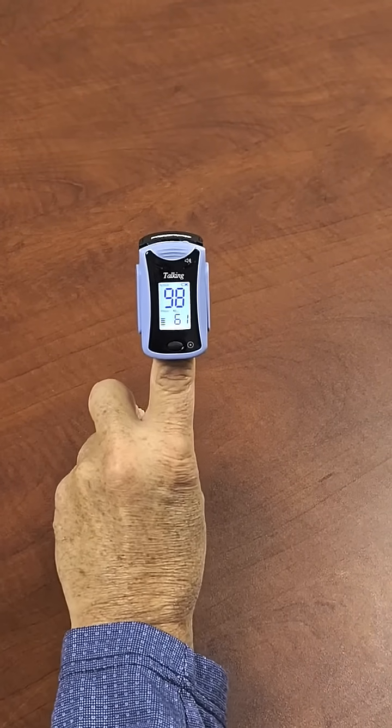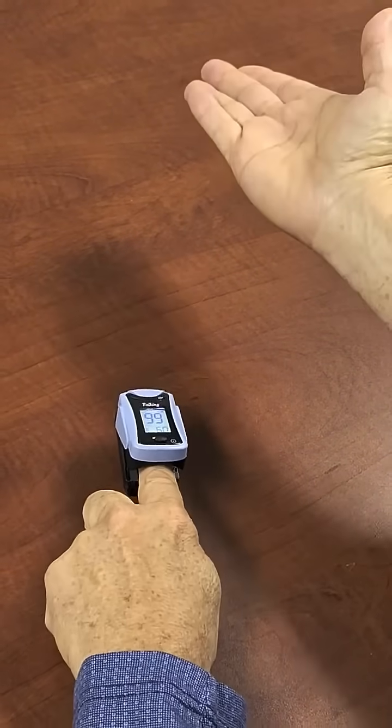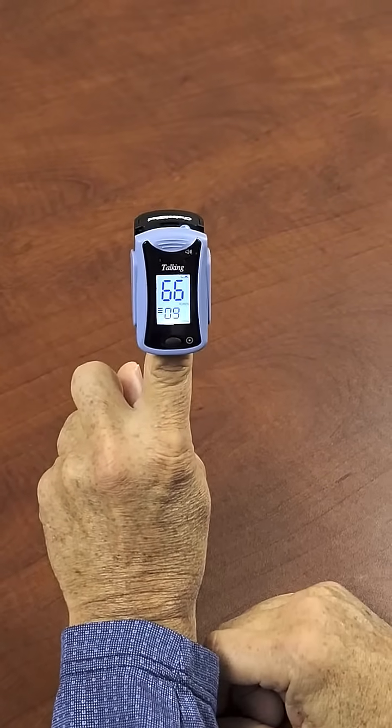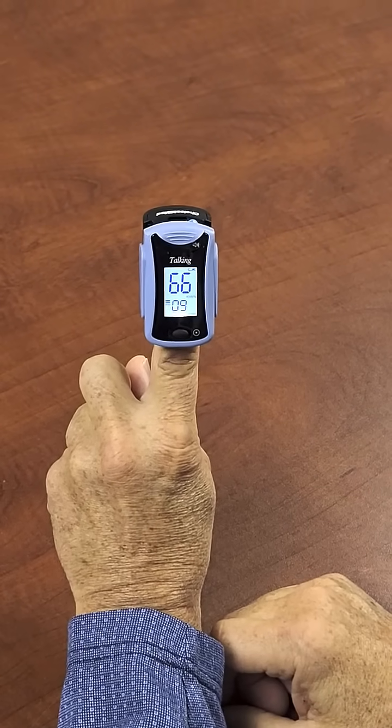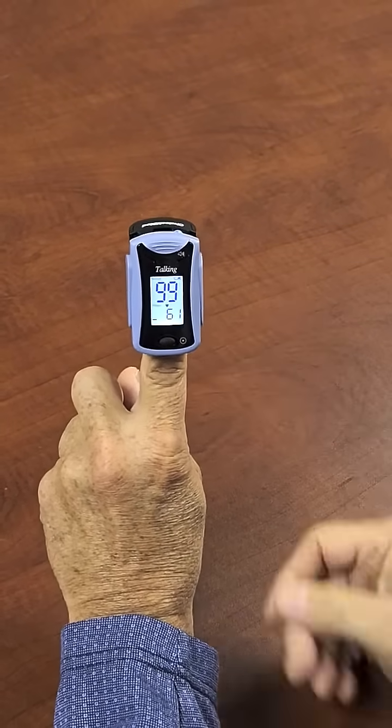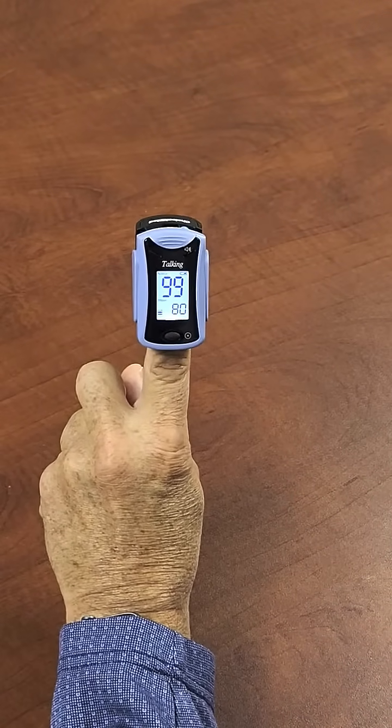You can also flip this display if there's somebody across from you that would like to see it. That turns it to a different orientation so a person can see it across from you. Press it again and it's back to the original orientation for you.